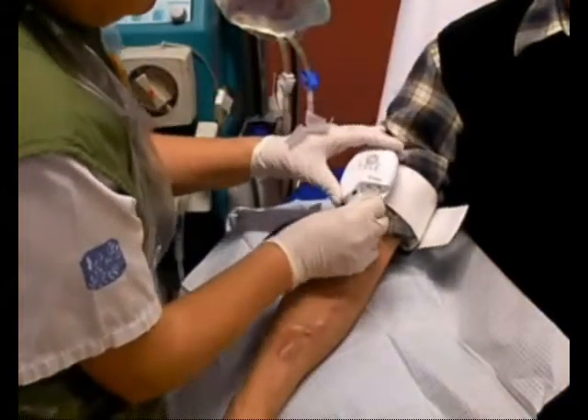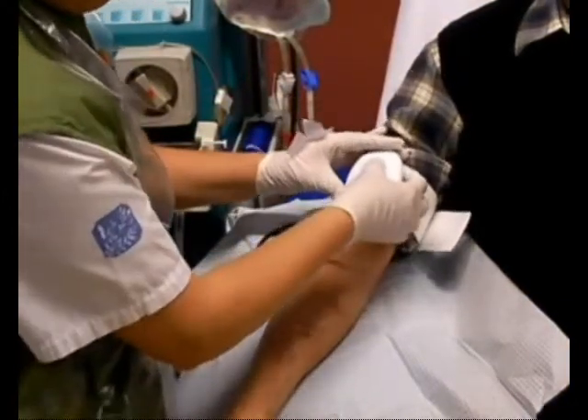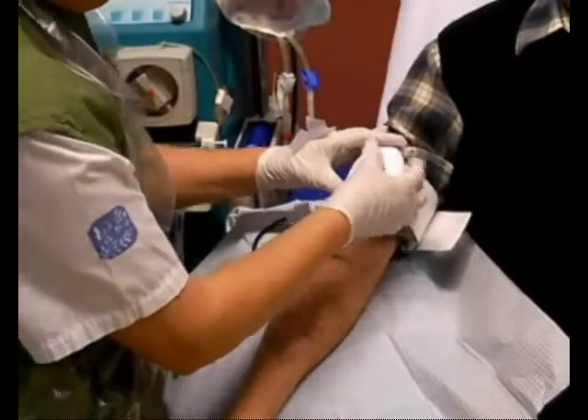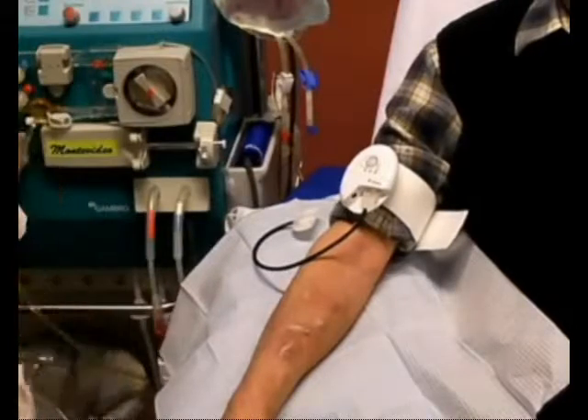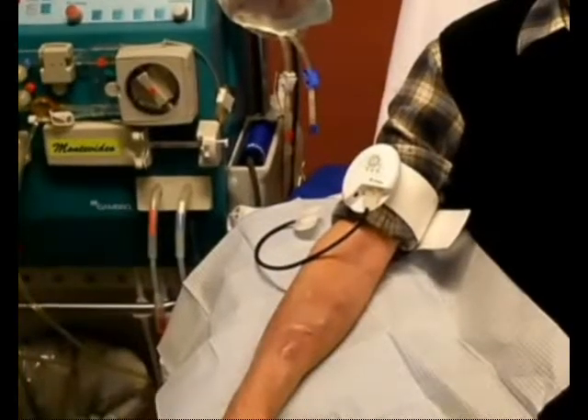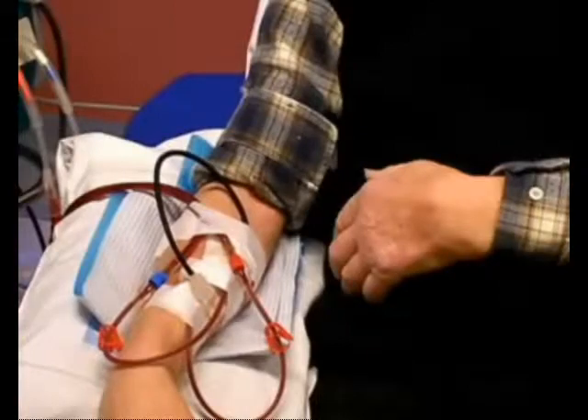To start RedSense, press the on button and confirm that all LEDs are lit and that the alarm signal is heard. Press the on button once again and the green light starts to blink for a few seconds — the assessment phase — showing the battery status and making sure that the sensor patch is properly connected before becoming completely lit.